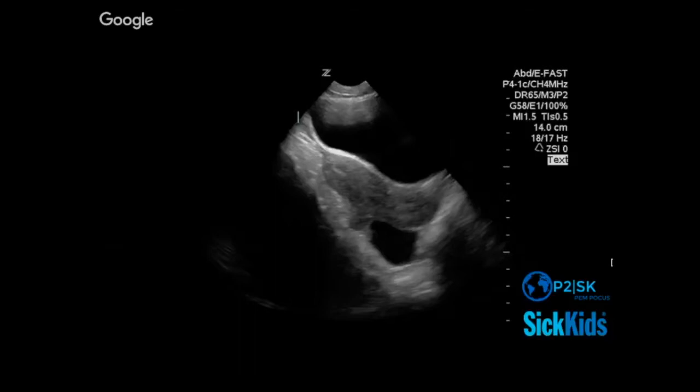And being a POCUS user and being like, I can answer these questions quickly, can put you at a little bit of tension with the team, where the nurses are at the right side of the bed also, and they're trying to do their things. And you're there with this big bulky machine, putting gel on the spots where they're trying to put monitor leads, or pulling off their monitor leads so you can put gel on those spots. And so there is the need sometimes, if you really believe that your POCUS can alter things, to be a little assertive, friendly assertive, about what you're doing has as much or more value as what the rest of the team is about to do. And a lot of just 'one second, I'll be out of your way in one second' kind of things can be useful.